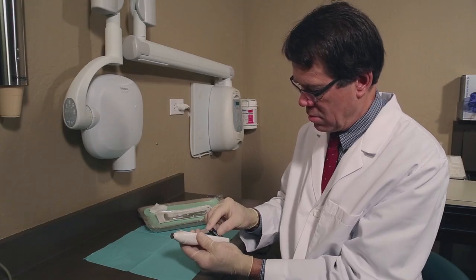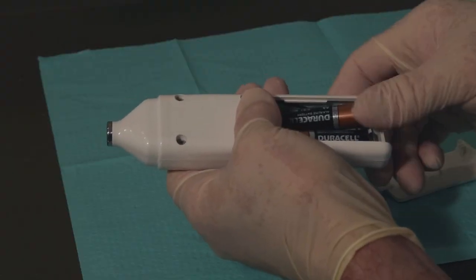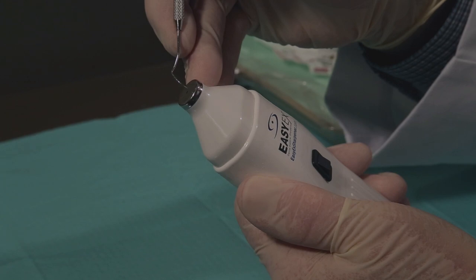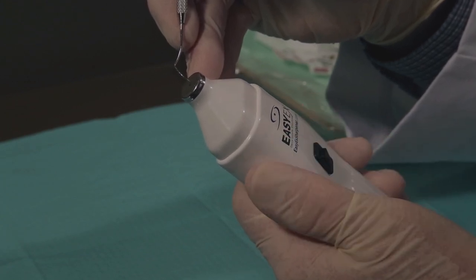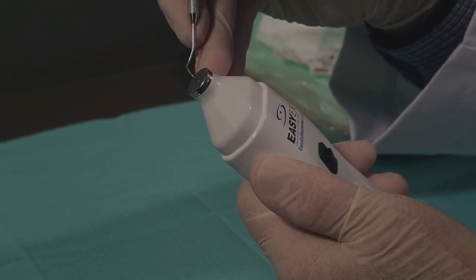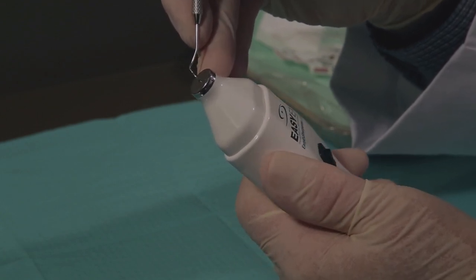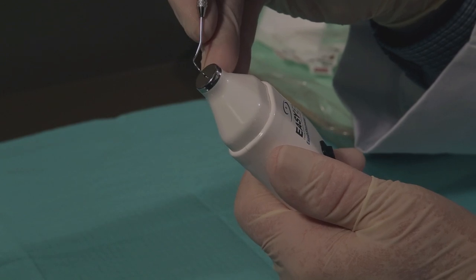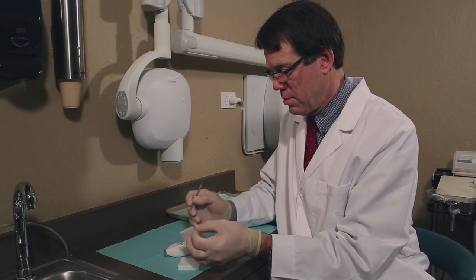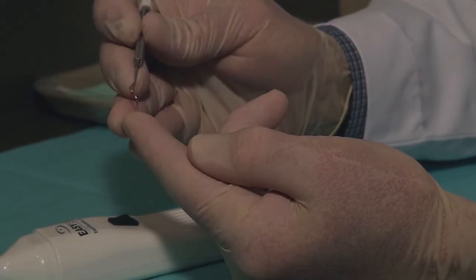The EZX operates with two AA batteries for portability in your practice. Begin by sterilizing your dull explorer. Turn the EZX on and insert the dull tip into the small hole on the top of your EZX. With light fingers, feel the tip engage the rotating stone and gently rotate the EZX to the right and left, then slightly up and down for a total of about 3 seconds. Wipe the tip with a 2x2 and check for sharpness. Very dull explorers may need a second sharpening.